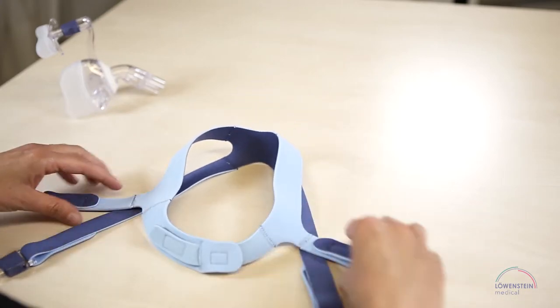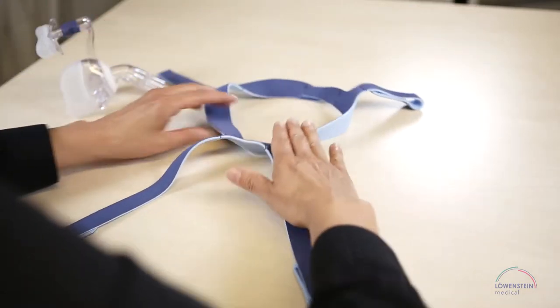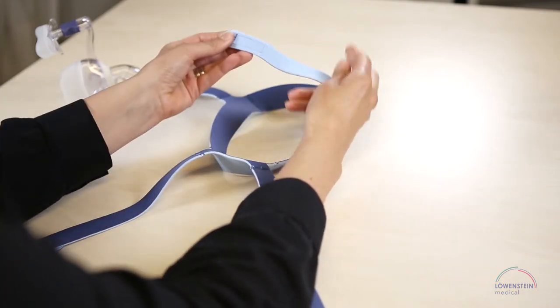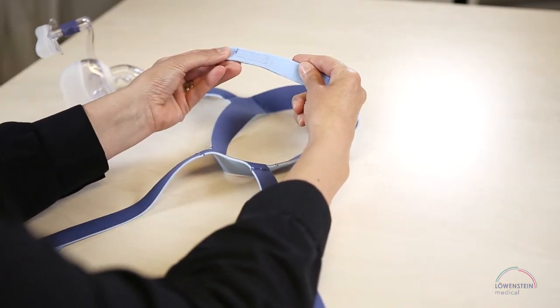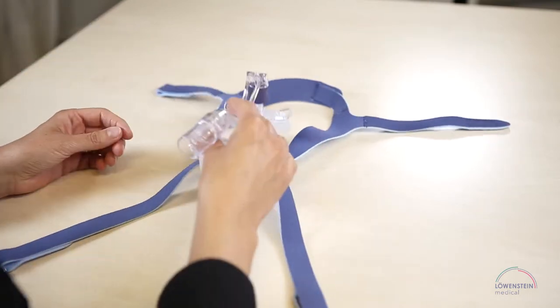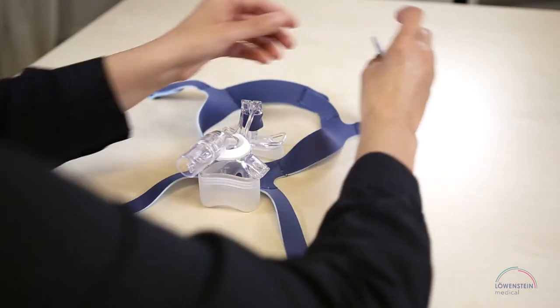For simple and correct assembly of the straps, lay the headgear with the light blue side down on the table. Look at the tabs to make sure that the correct color is in the right place. Place the mask on the headgear and connect all four ends with the mask.